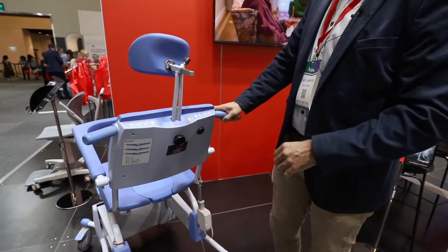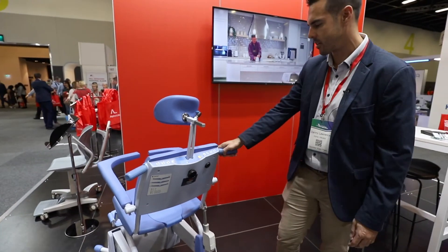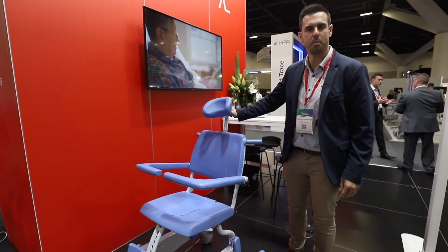One of the biggest features is that it's got an integrated control panel, on both sides. There's no remote on a cord that can get damaged. So there you go — the L'Opital Reflex.